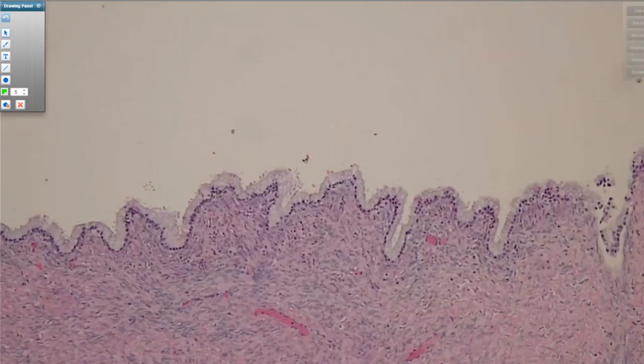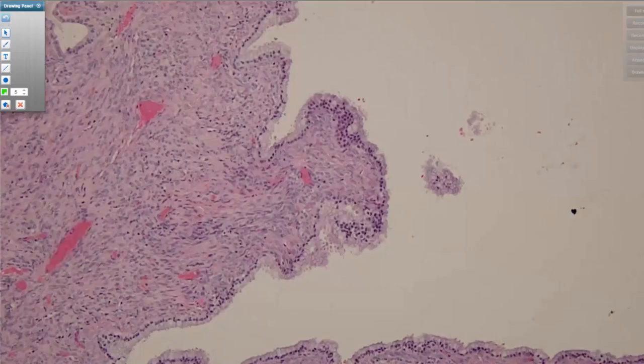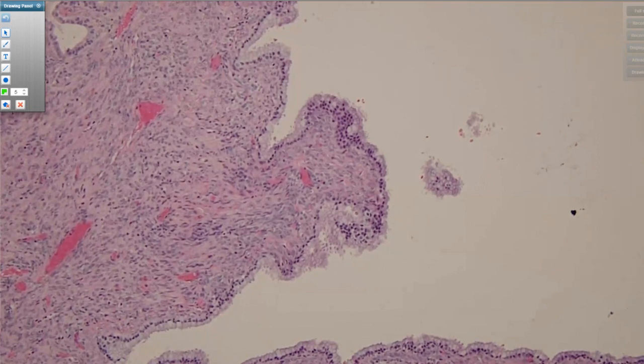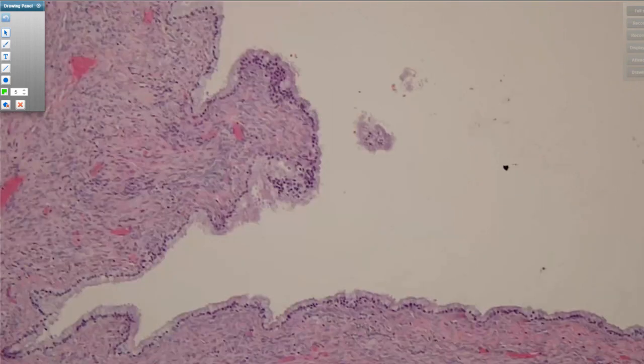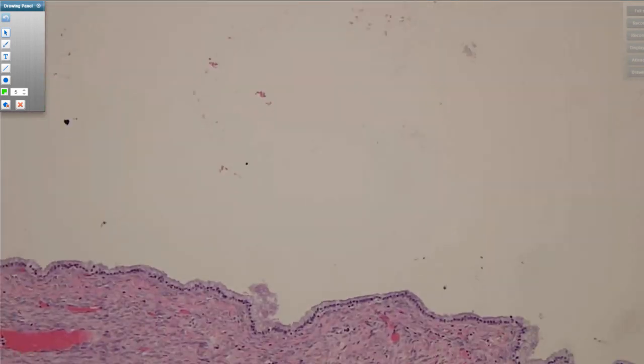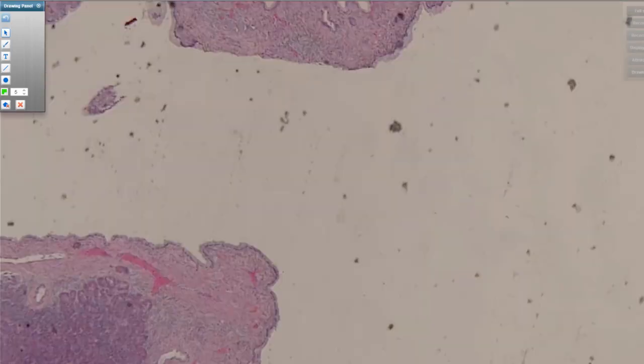Another thing that can be cute is that in younger women, the stroma can also respond to the menstrual cycle, and so it'll become luteinized looking under the influence of progesterone, and will become plumper and rounder, more pink appearing. And in those situations, sometimes they'll actually stain for inhibin, which again is not really diagnostically useful, just sort of cute to see.